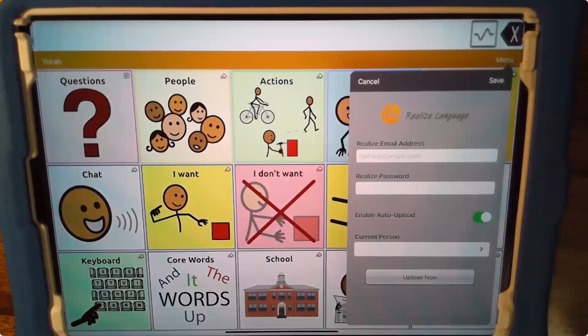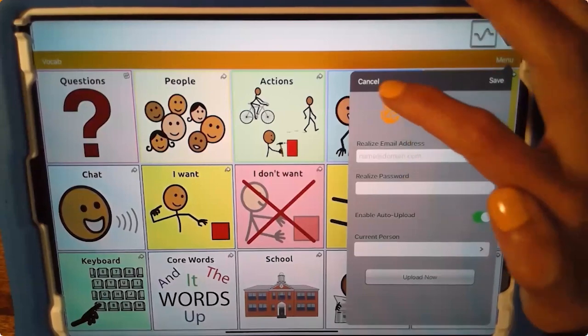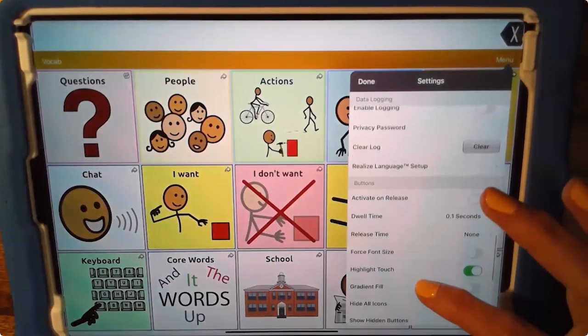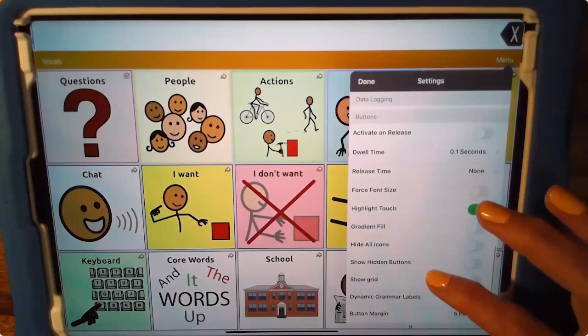But then from like 10 to 2, we're a little more spaced out. What kind of an activity could we be using the device for? Thank you, Courtney, for that information in there. So it's a great tool to be utilized for gathering that information and helping guide your implementation with your AAC users.